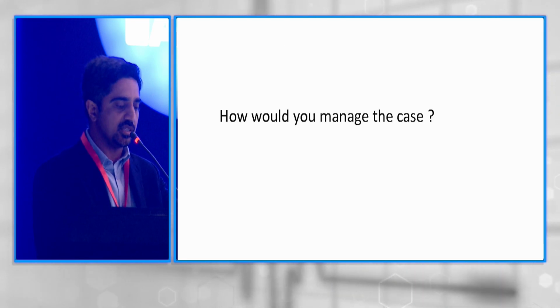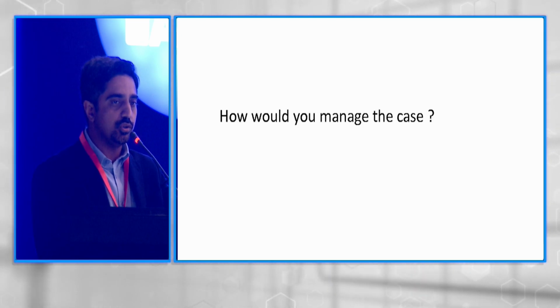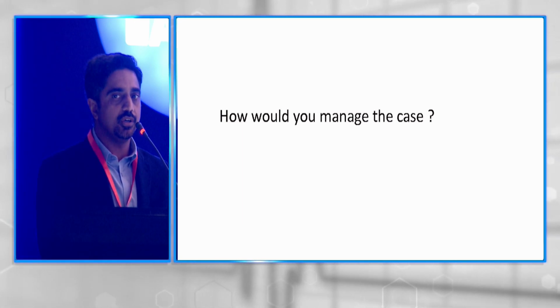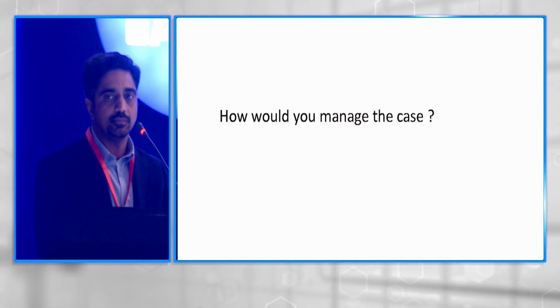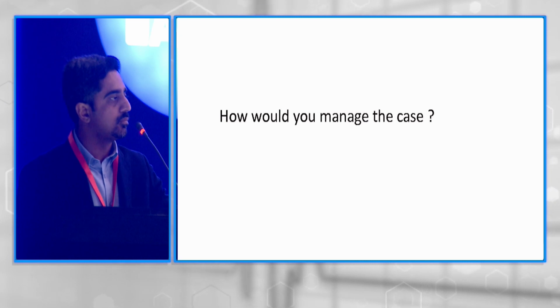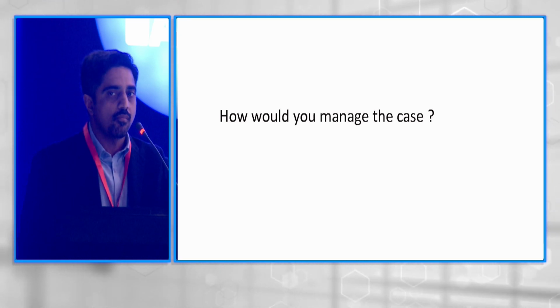So how would you manage the case? It is a total occlusion at the LAD ostium involving a gradual re-occlusion of a stent. Let's get two quick comments before we move on to how he did it. Asad, how would you proceed with this case?